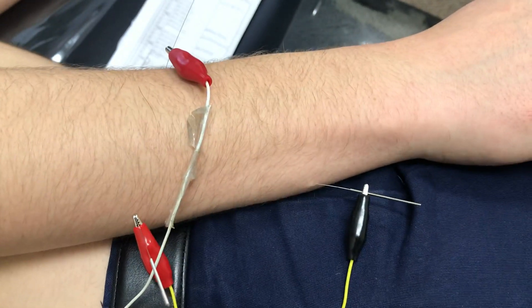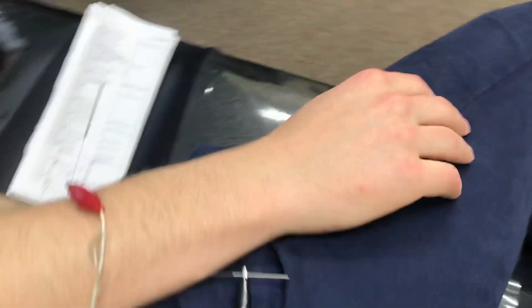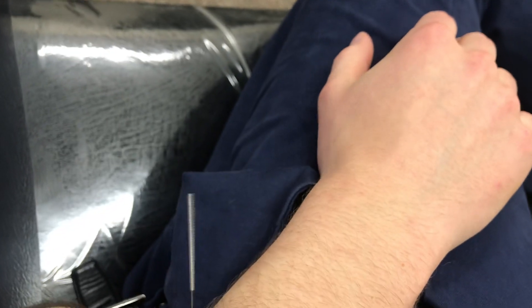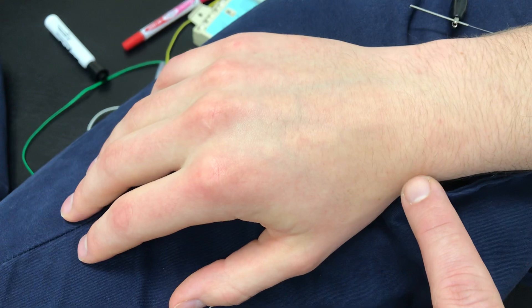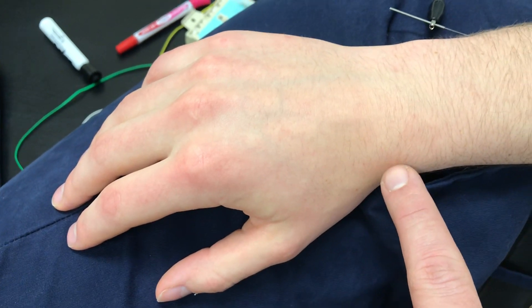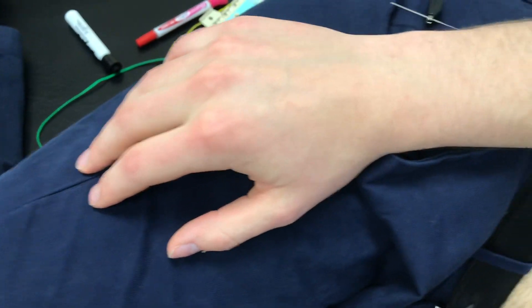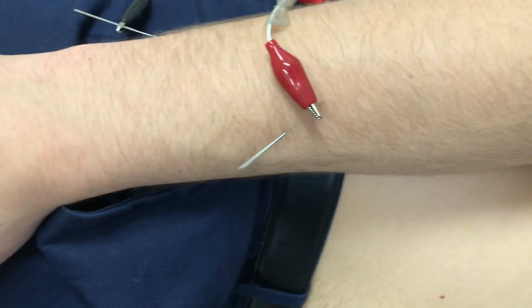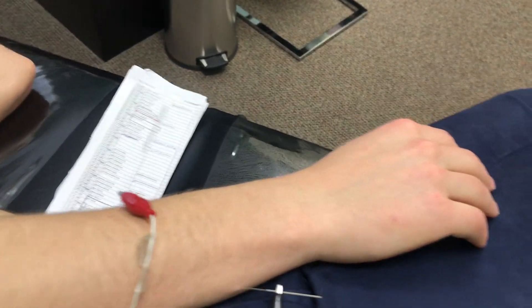I'm going to shut down the ulnar channel so we can see what the deep radial nerve stimulation is doing on its own. This is important — this is where a lot of the pain is coming from, as we saw in earlier videos. It's coming from the snuff box, and you can see how that extends all the way up. If we shut this one down and just turn on the other, I'll show you what the flexion looks like.